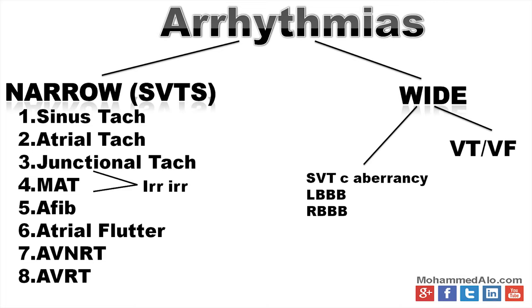So sinus rhythm or sinus tach is the normal response to exercise, hypovolemia, fever. If a patient is in sinus tach, it's an appropriate response to some disturbance going on in their body. They have a fever, they're hypovolemic, hypotensive, maybe they took a medication, maybe they just exercised. If I stand up right now and start running in place, I will be going to sinus tach. Usually you slowly go into sinus tach and slowly come out of it. If you don't, then it's probably some other rhythm. If it's a sudden onset or sudden offset, it's probably something else. So sinus tachycardia is pretty normal, and I wouldn't get too excited about it.